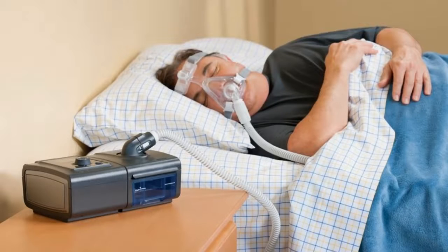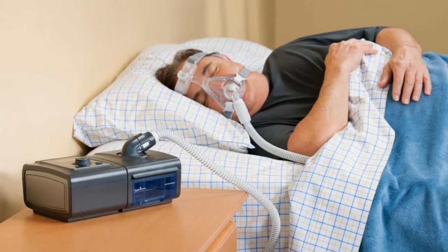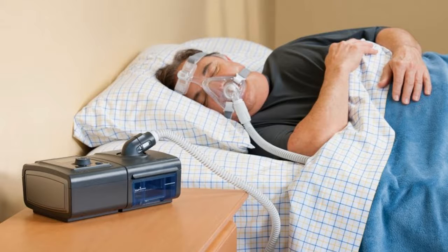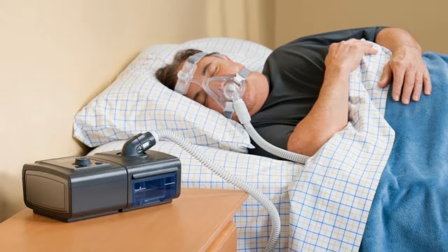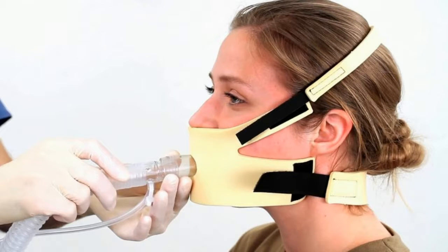Difference between CPAP and BiPAP. Sleep apnea machines are prescribed for sleeping disorders. There are two types of machines: a CPAP and BiPAP. By keeping airways open, those who have sleep apnea can sleep without the dangers of not breathing.